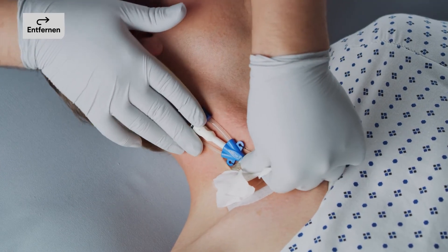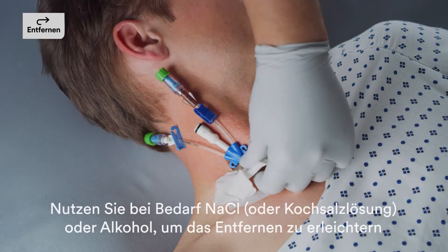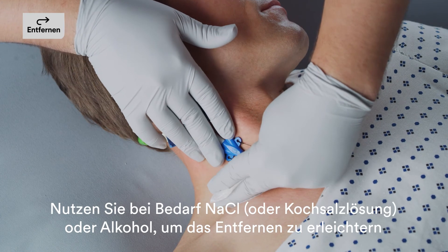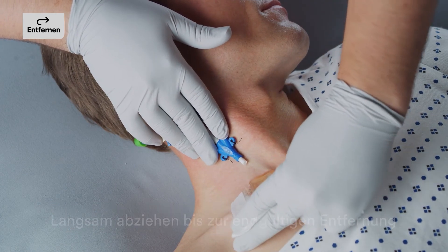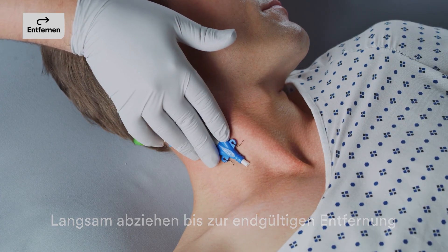When the CHG gel pad is exposed, grasp a corner of the gel pad and the transparent film dressing between thumb and finger. Apply a few drops of sterile saline or alcohol if needed to facilitate removal of the gel pad. Continue the low and slow removal method until the dressing is completely removed.